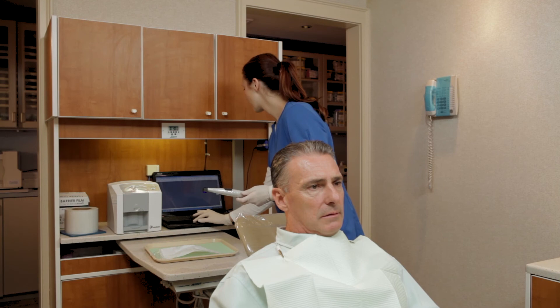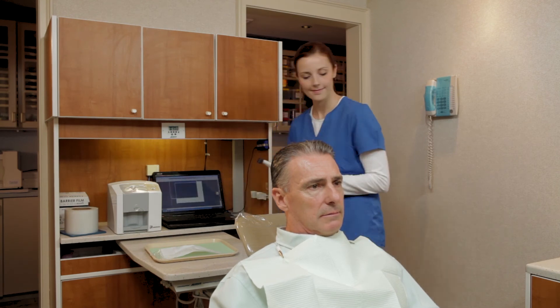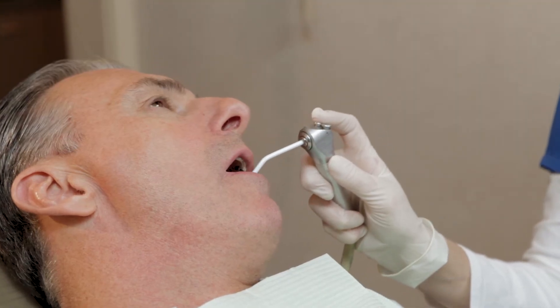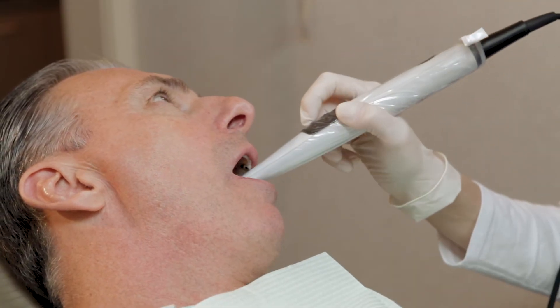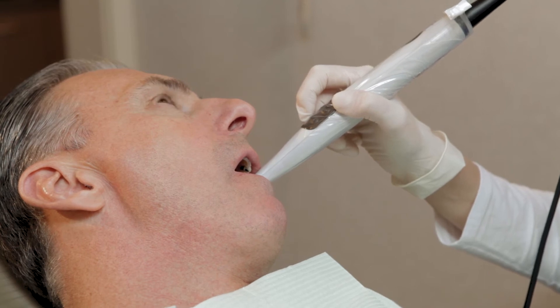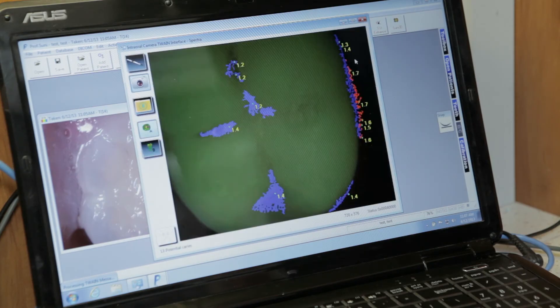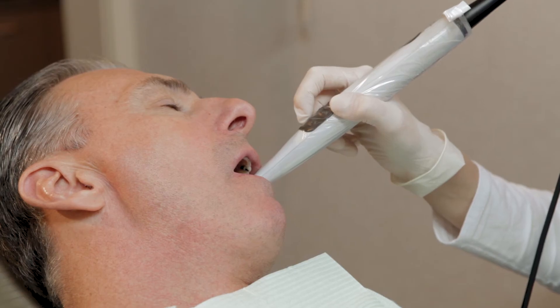Open the patient's record and click on Spectra. Note that there's no need for calibration as Spectra is self-calibrating. The teeth need to be dry and free of organic debris. Place Spectra over the tooth and line it up on your monitor. The top button will freeze the image. Press the Save button for 3 seconds and the image will be saved. Then move on to the next tooth and repeat the procedure.